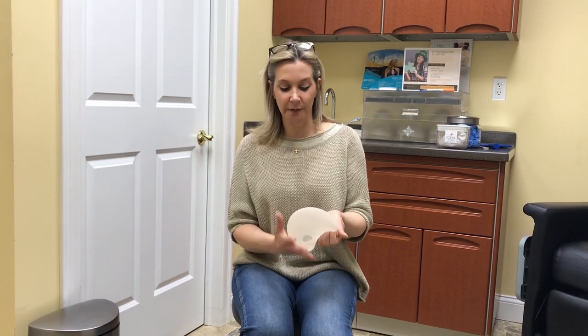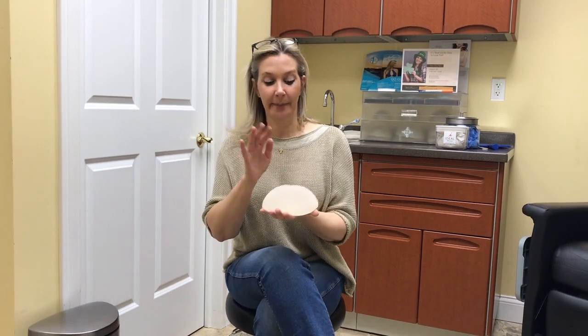Minimizing bleeding, making sure the pocket is clean. But there are a couple other things that we can do to minimize the risk of capsular contracture. We use Singulair, which is an allergy medication. We use it at night for about a month or two after surgery so that it decreases inflammation. So we're always paying attention to this. I used to put textured implants in because there is a lower risk of capsular contracture with textured implants, but on balance, I don't think that any risk of having a lymphoma is worth the risk of negating capsular contracture.